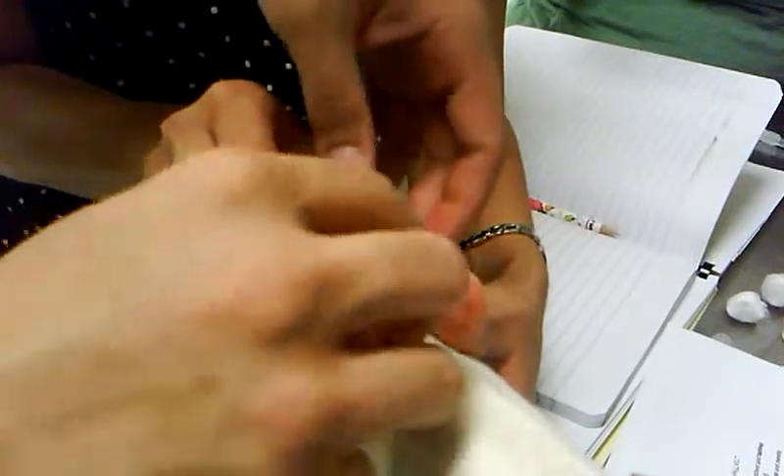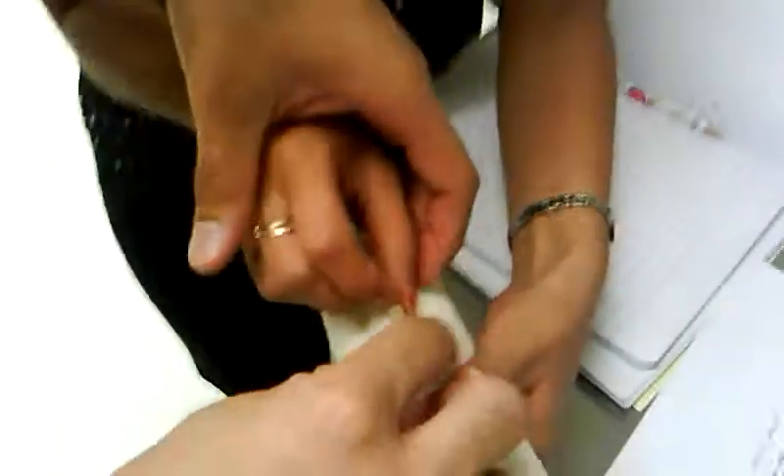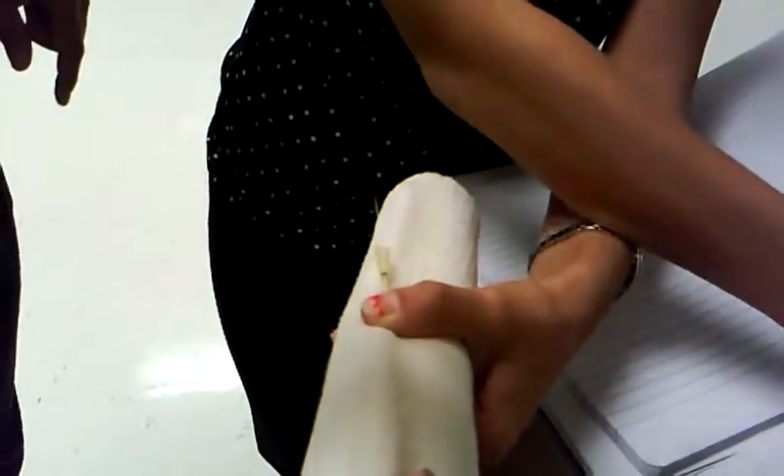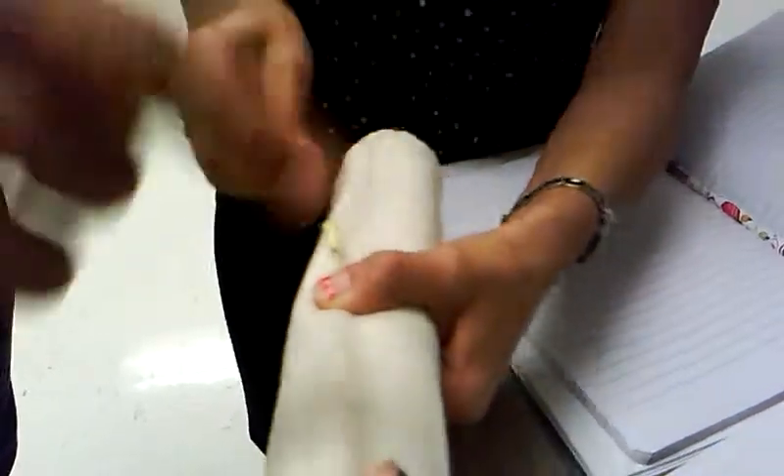Once you're in and you see blood, you're going to hold it in place. And then you're going to push that in, pull the stylet out, put your thumb down, take the end off of that quickly, and put it in there.